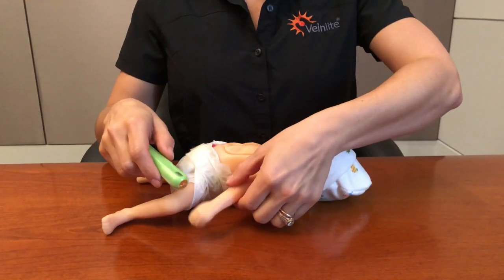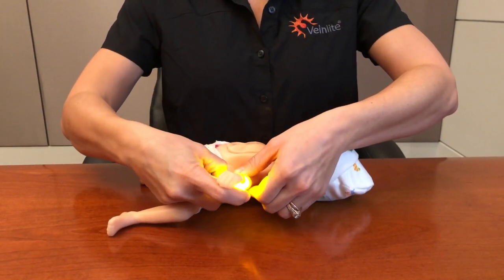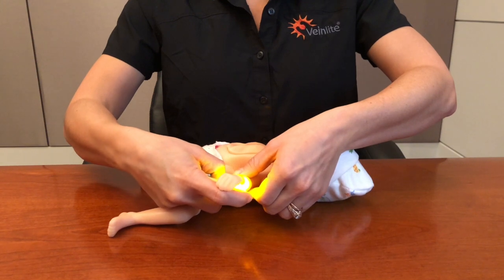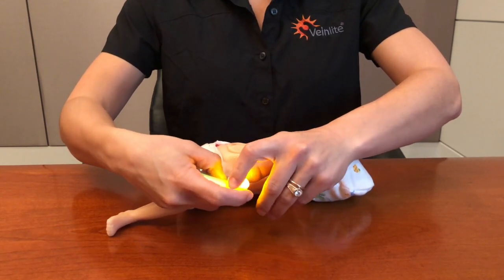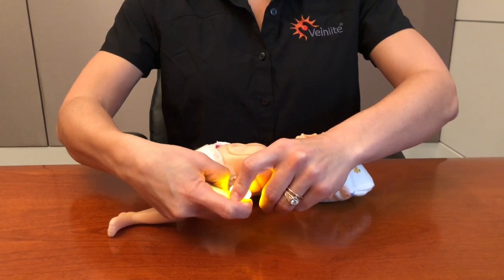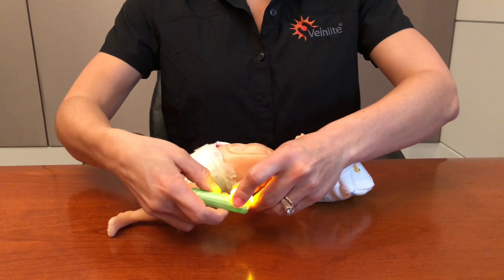Place the Neo under the patient's hand, arm, foot, or other extremity. Turn the Neo on, cycle through and find the desired color and brightness, and secure the patient. You're ready for access!